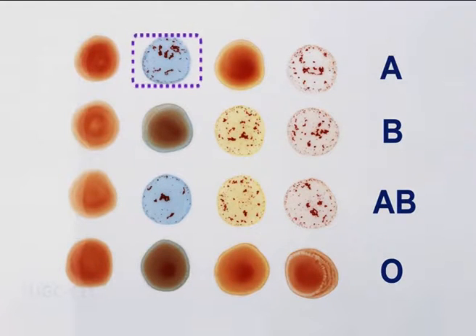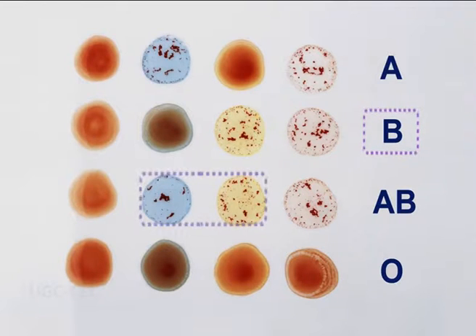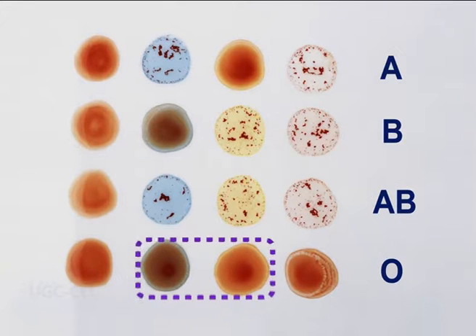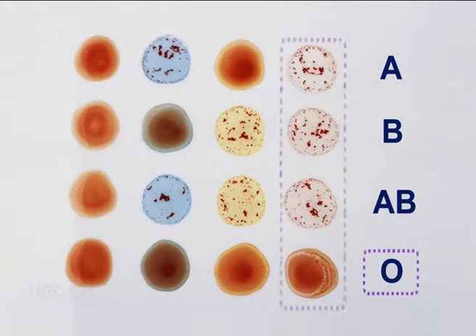If agglutination occurs on side A only, the individual has blood type A. If it occurs on side B only, the individual has blood type B. If a reaction occurs on both sides, the individual has type AB. If no reaction occurs on either side, the individual has type O.